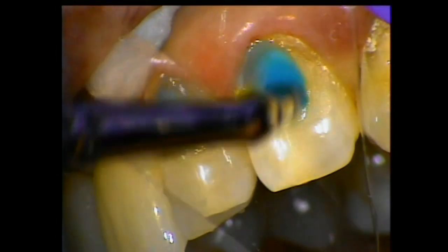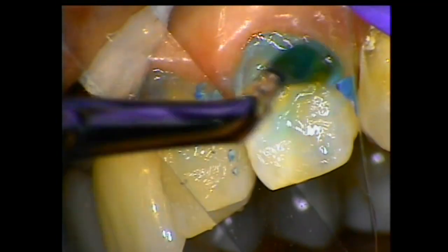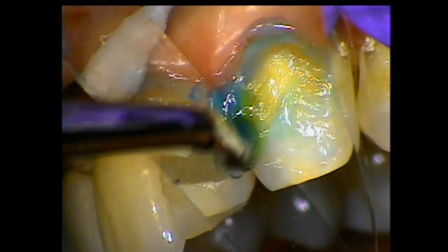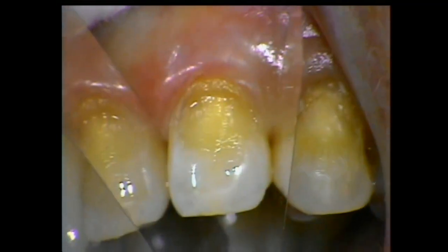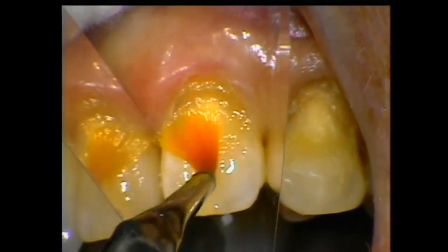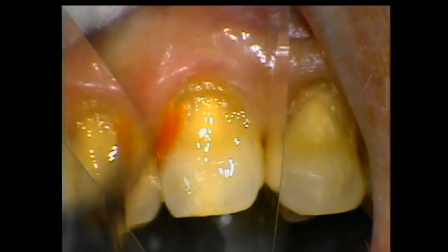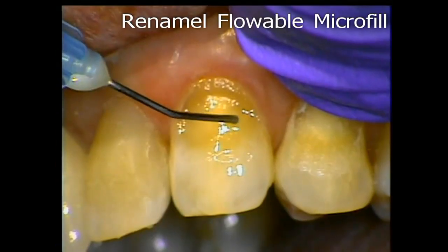Now we'll apply the etchant. These are the Cosmedent brushes — the reason I use brushes is because I can get the etchant down beneath the free margin without irritating it. So now we take the bonding agent and we apply it, then we flood it. Three coats — that's all you need.